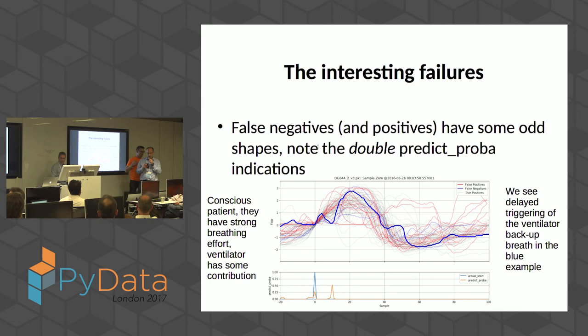So the question has been, how easy is it for a human eye to identify the start of the breath? We did that, and I started to do some manual annotation myself, and also had a student who did quite a lot of manual annotation for me on different patients. So I now have a training data set, which I can use with any model. But I have to say, I've cheated a bit, because I've sent the most difficult data to build a classifier for. So these are two extreme cases here.